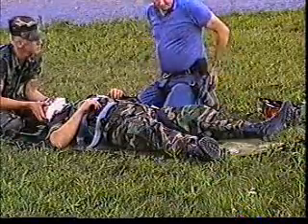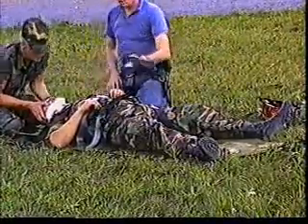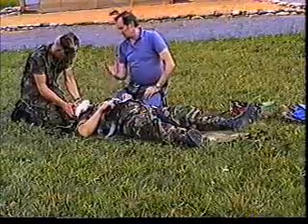At this point, we want to be securing the patient's head. So before he lets go to take these straps, I'm going to do something here that people don't think about. We want to make sure this head does not move.